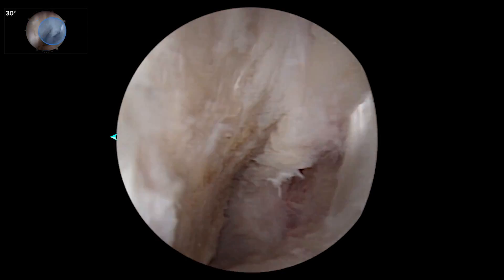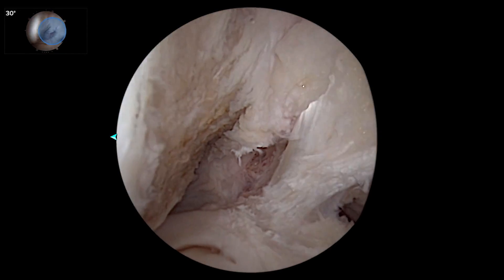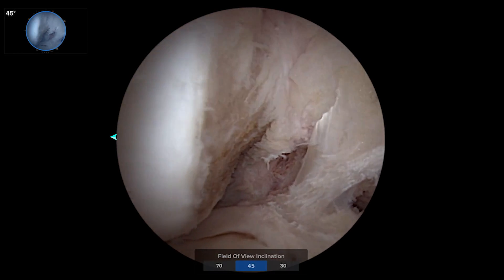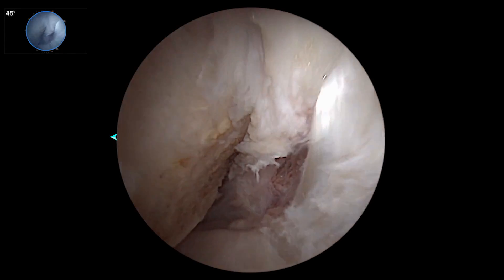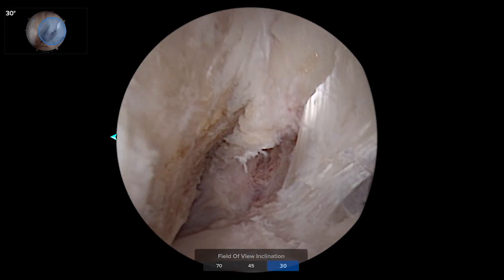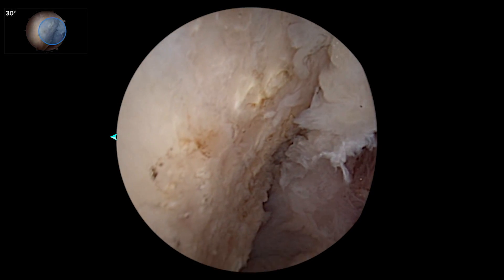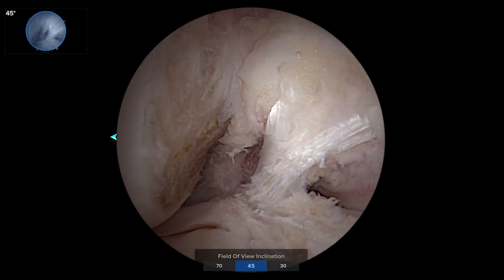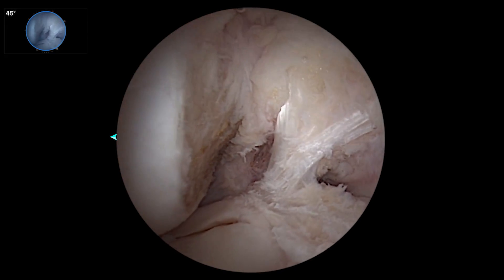Viewing through the anterolateral portal — our typical lateral wall view where you have to push up against the wall — if I go to the wide angle, it just immediately comes into view and gives me a much better depth perception. I feel like I'm working down a sheet of paper or something. From 30, to get to that back wall I kind of have to angle at it. In the wide-angle view, it just puts it all in view right there, even keeping the articular cartilage in my field of view, which I think will make it safer.